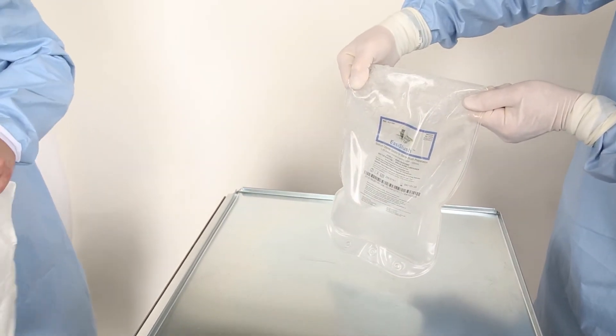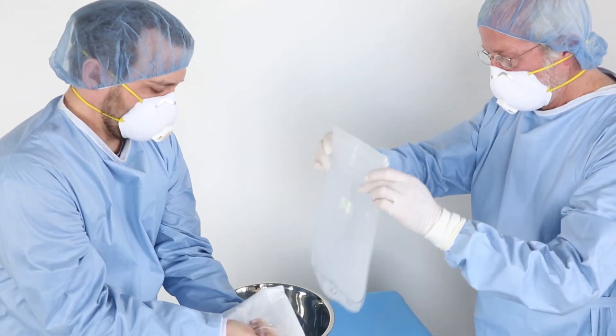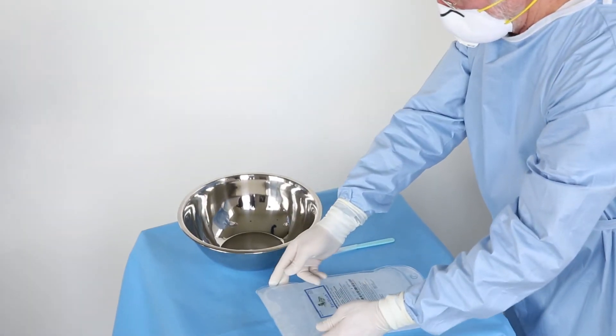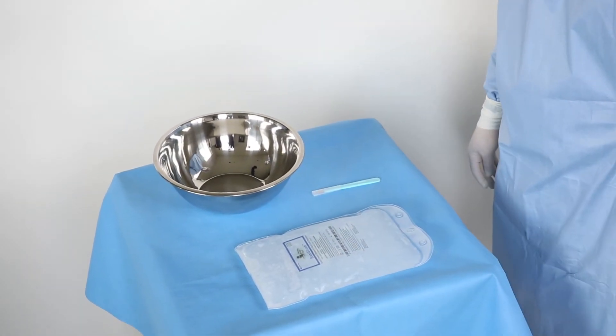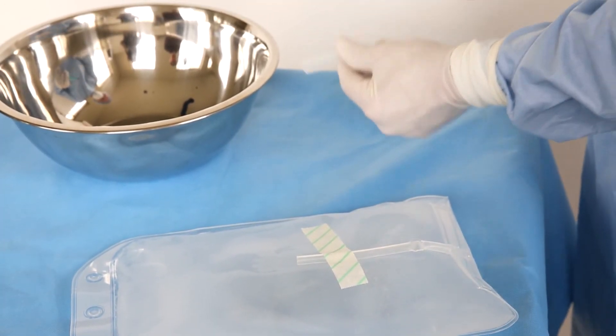Using aseptic technique and exercising caution to avoid touch contamination, present the solution bag to a designated person in the sterile field. The person in the sterile field should remove the Easy Slush bag and bring it into the sterile environment.